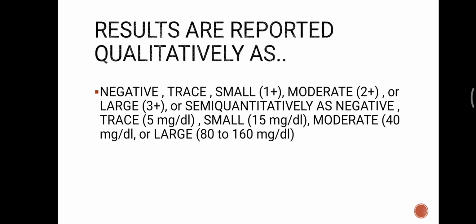Okay, so how will you report those results qualitatively? So in ganito, negative, then trace, or small 1+, and then moderate 2+, or large 3+, and then semi-quantitatively naman as negative, trace, we have 5 milligrams per dL, and then small, then 15 milligrams per dL, and then moderate from 40 milligrams per dL, or large is from 80 to 160 milligrams per dL.